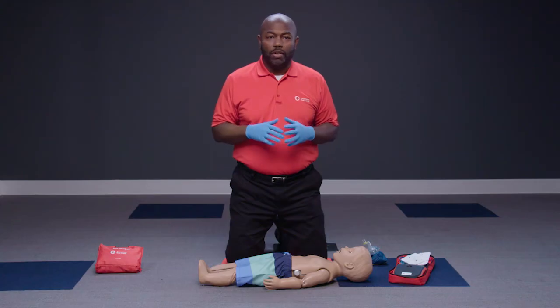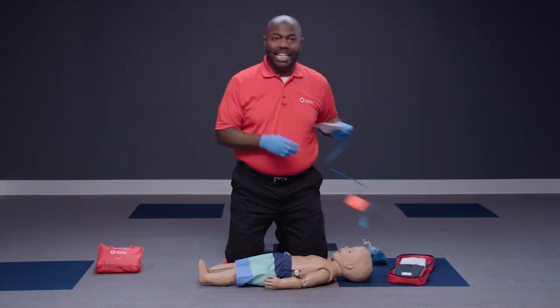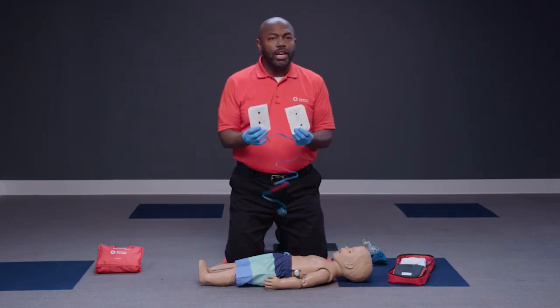AEDs work the same way regardless of the person's age and size. However, there are some differences in AED pad selection and positioning when providing care for younger or smaller children and infants. For children up to 8 years of age, including infants, and/or weighing less than 55 pounds or 25 kilograms, use pediatric AED pads to deliver a lower energy dose.